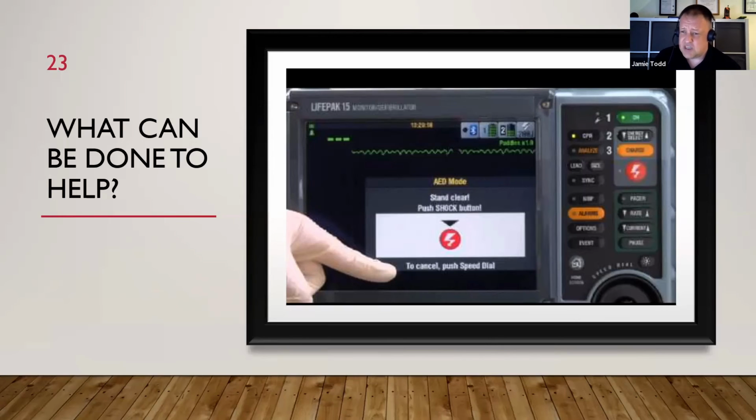And it's accepting in those services as well. They're using quite antiquated monitors that are really slow in AED mode. Yeah, they're slow to analyze and slow to charge. And the machines are quite old, so the batteries aren't very good, so they're quite slow to charge. And yet in those services, they still deem that to be safer than the risk of shocks not being delivered. Because in AED mode, even if it's slow, you will never get a fail to shock because the machines are pretty good. Anything that it thinks is shockable, it will shock. And it also releases a lot of bandwidth.